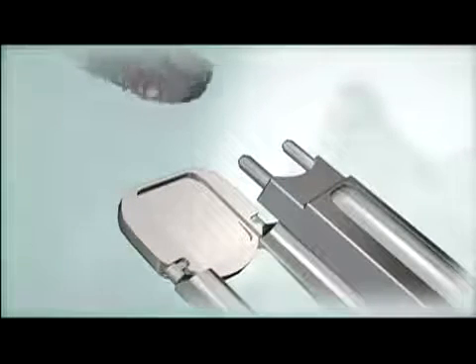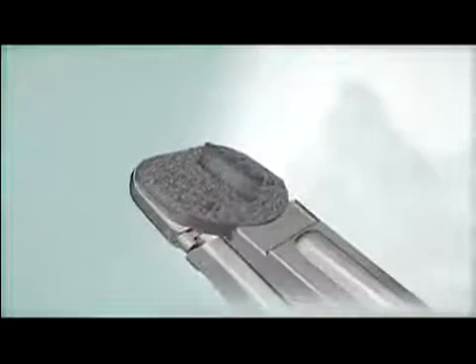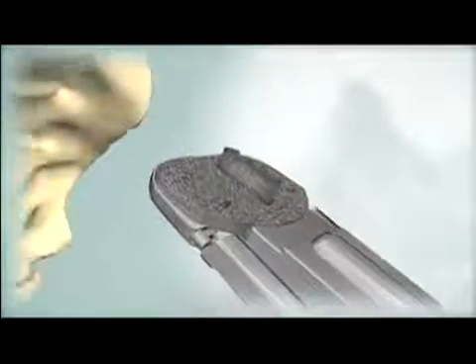Load the inferior end plate and superior end plate onto the inserter and nest the two end plates together. Remove the chisel and trial. Align the keels of the ProDisc-L implant with the chisel cuts and insert the end plates to the posterior margin of the vertebral bodies.